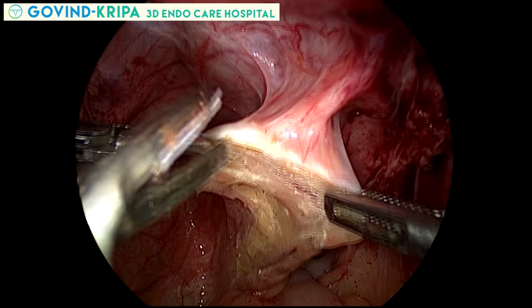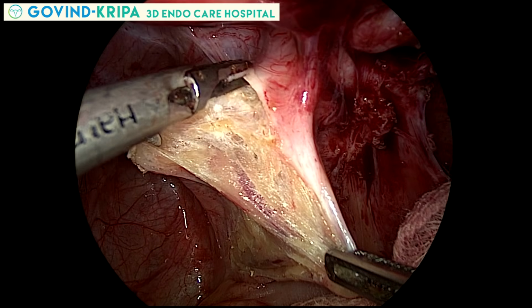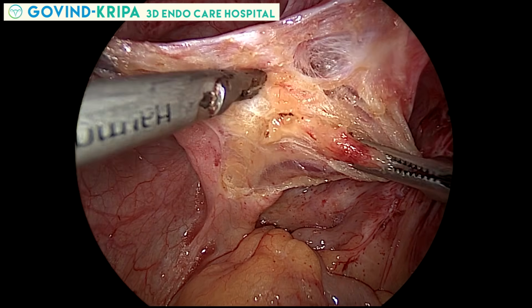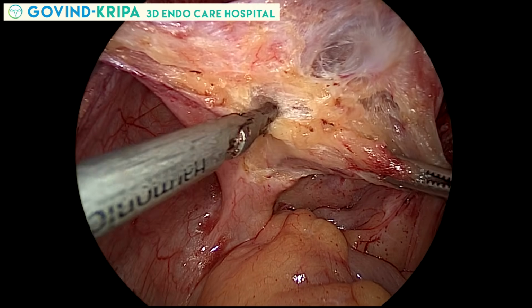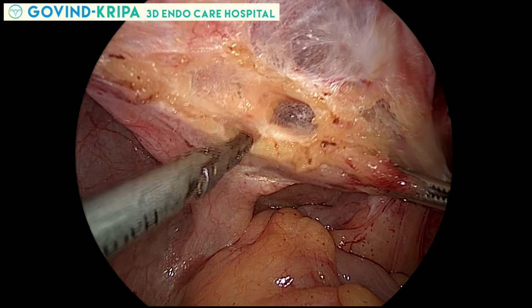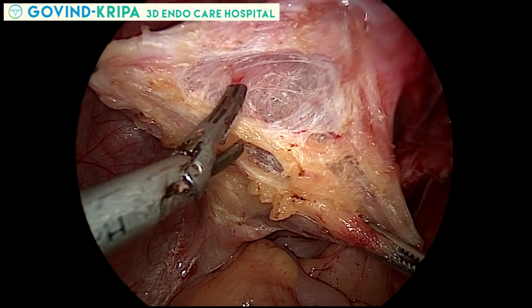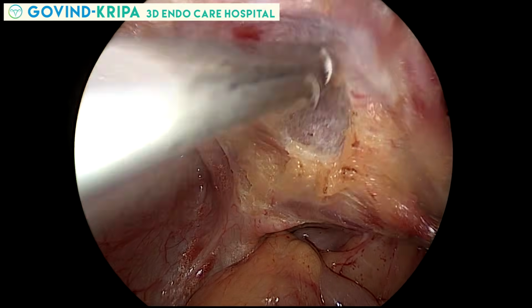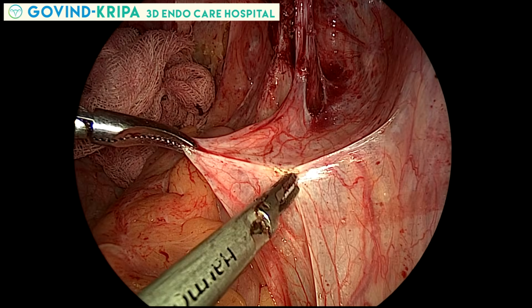Traction and the counter traction is essential to navigate into the proper plane. Similar steps are performed on the right side.